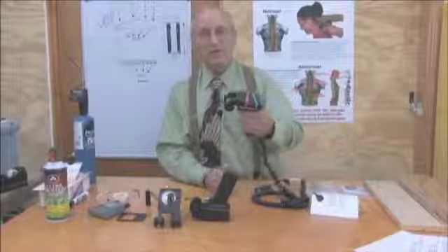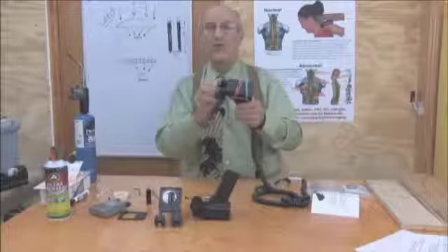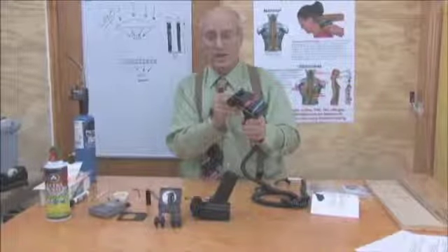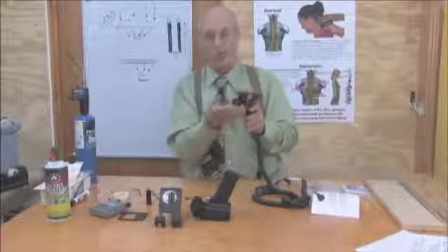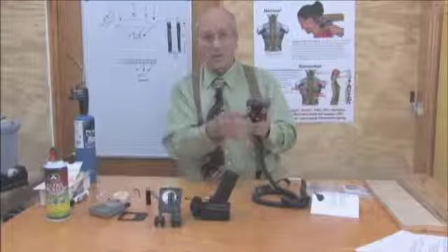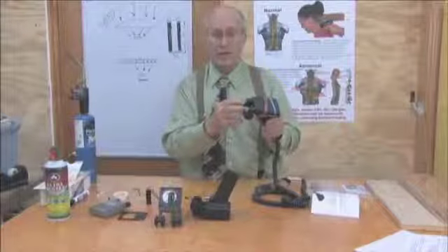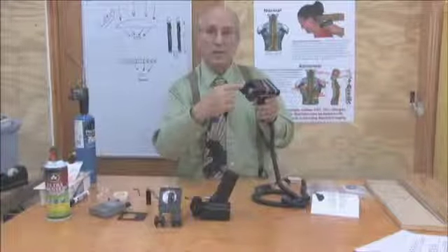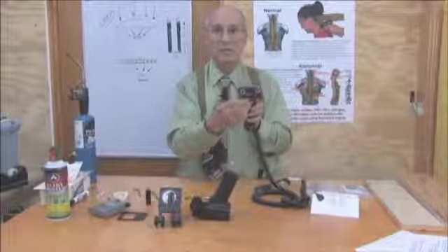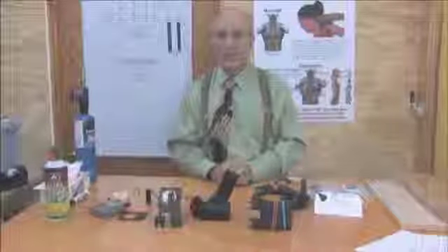The previous scanners, the C3000s, the struts were made of brass, and when dropped, they can bend. It's usually not difficult to bend them back into place. If one gets dropped like this and the tires are pushed up against the barrels to where they don't turn easily, a flat bladed screwdriver, and I usually put a little tape around it to protect the finish of the scanner, placed between the barrel and the strut, can bend down and reestablish clearance so the wheels turn. So those are some of the tricks to repairing a scanner that has been dropped.